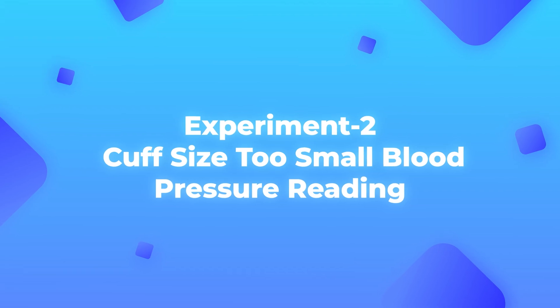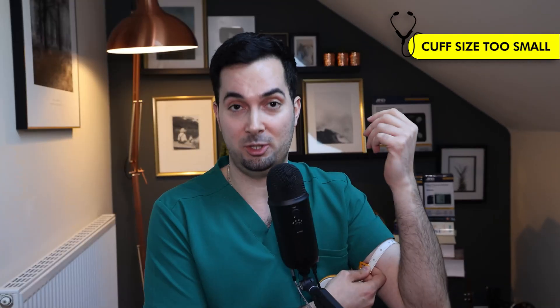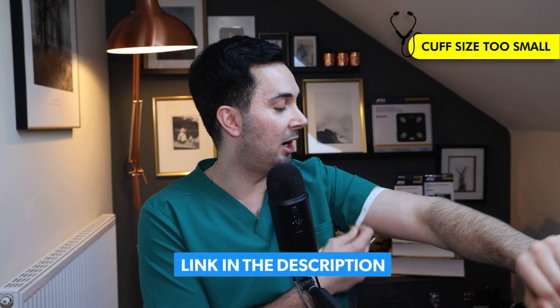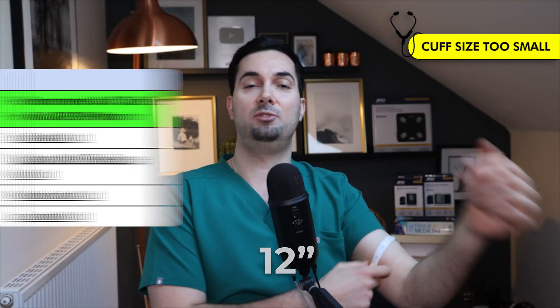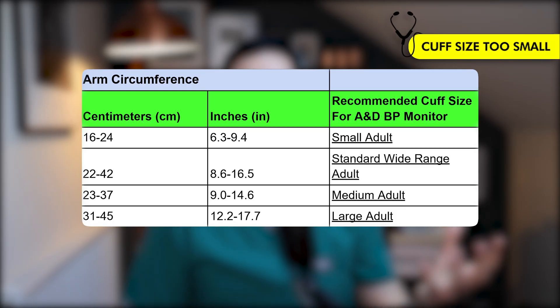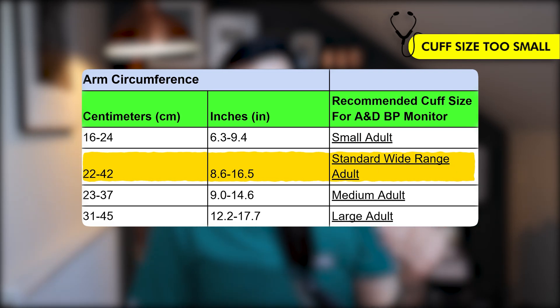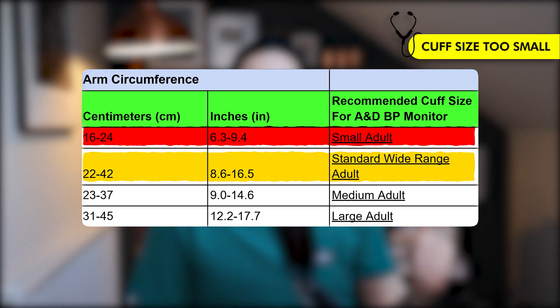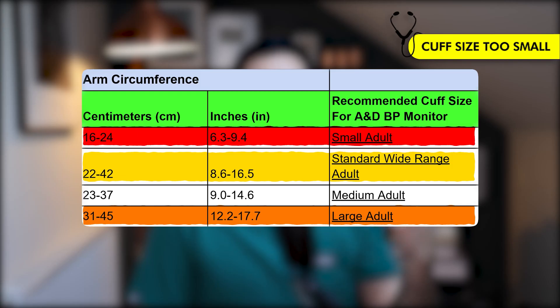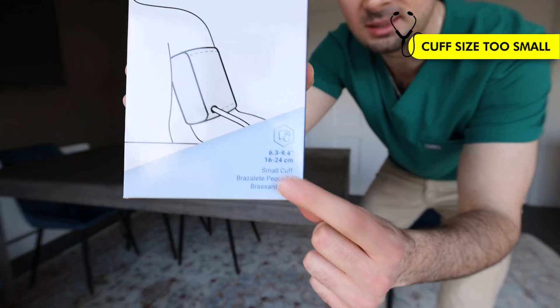Moving on to experiment number two — I've taken my white coat off for this one: using a cuff that is too small for my arm. I've got my measuring tape and already calculated my midpoint. My arm circumference is about 12 inches. Looking at the table on screen, 12 inches is correct for the wide-range cuff that comes standard with most A&D medical devices. The small adult cuff is too small for me — that's what I'll use for this experiment. Everything else is done correctly; the only difference is the cuff size.